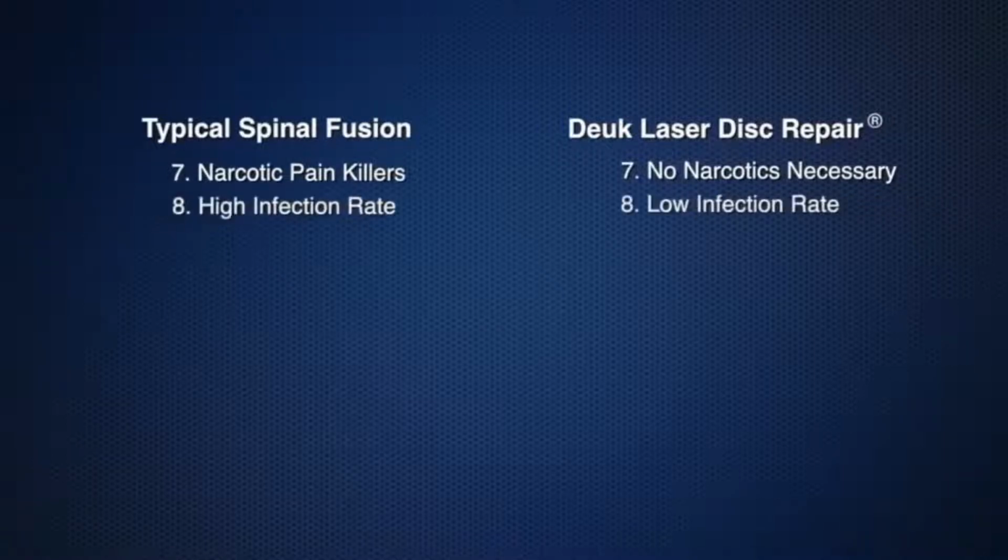Spinal fusions have a high risk for infection. The Deuk laser disc repair has a very low risk for infection. In the 7 years the Deuk laser disc repair has been performed, there have been no infections.